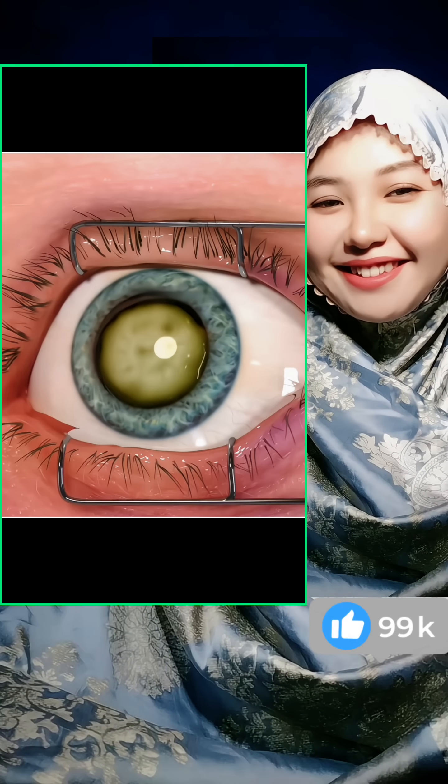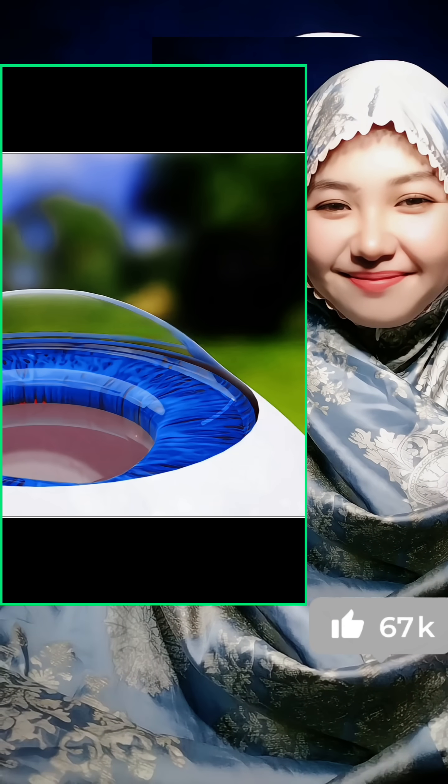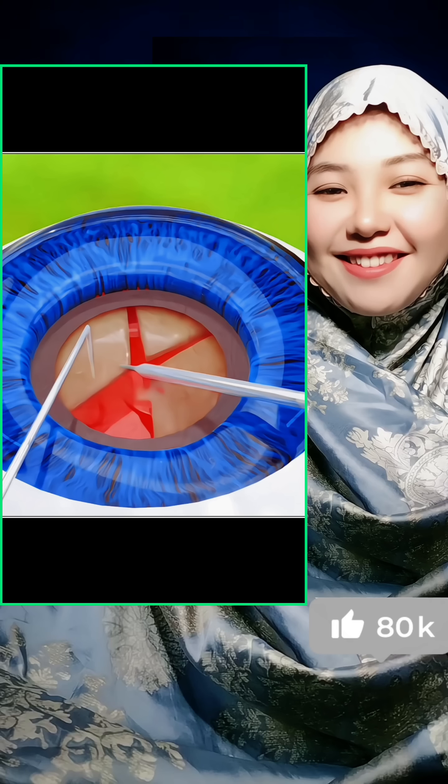The surgeon begins by making a tiny cut at the edge of the cornea and inserting a small probe. This probe uses gentle ultrasound waves to break the cloudy lens into tiny fragments, which are then suctioned out.